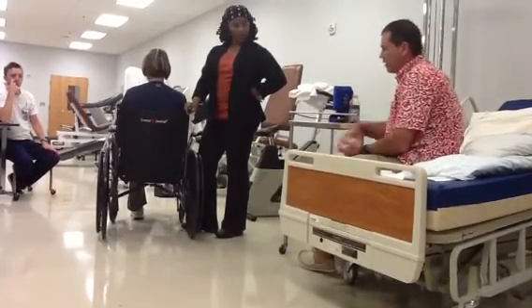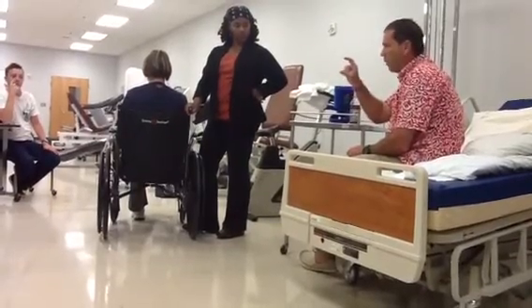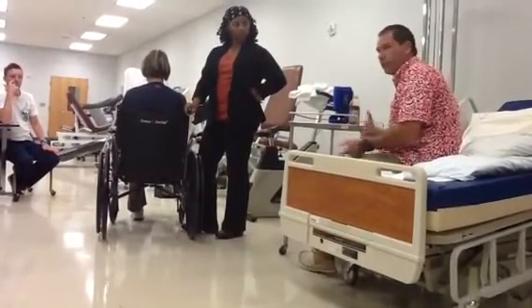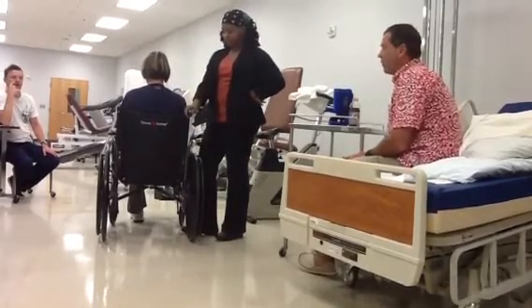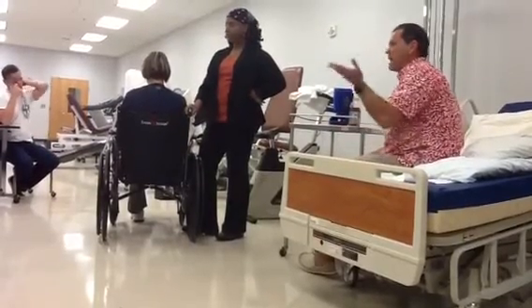But sitting the way it is, I would prefer it to be about that far below the inferior border of the scapula. Because that's going to make her have to have some support instead of just giving her all the support. We don't want to give her all the support. But once you put that pillow in there, then that might take her up enough. The thing about those pillows is they just compress, so you don't end up as high as you think you're going to.